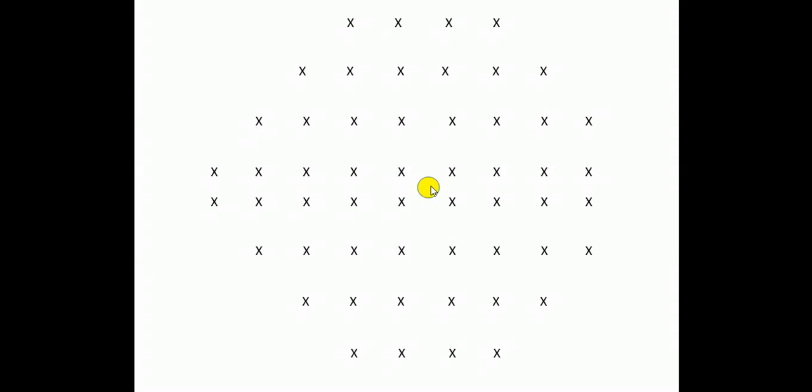Obviously, as the test is going on, if there's a stimulus here and the patient's looking up here, then that's not testing their peripheral vision. The whole idea, and it's quite difficult for patients, is not to look at the stimulus. They have to be focused here the entire time. Well, how do we know if a patient's score comes out seemingly very normal, whether they were truly looking at the target the whole time when we were testing their peripheral vision, or maybe they were just always looking around carefully for when there would be a light flashing and then they would press the button?